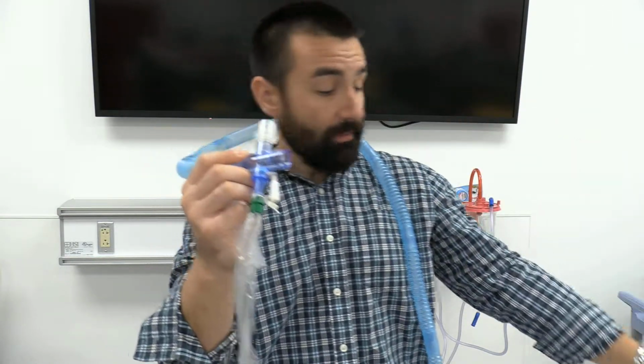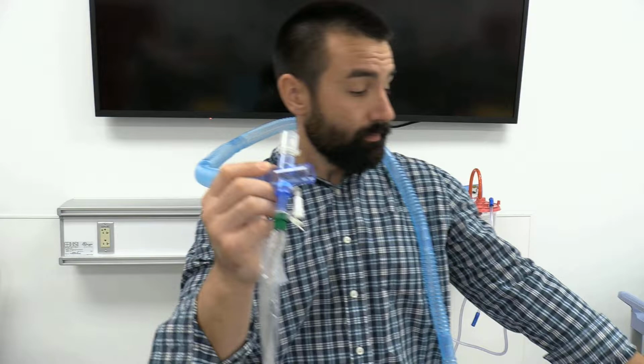So if you're taking a patient who already has an inline suction, we're going to take this little white cap off the side, and we're going to take this little piece of flex tubing and hook it up like that so they have a place to exhale.